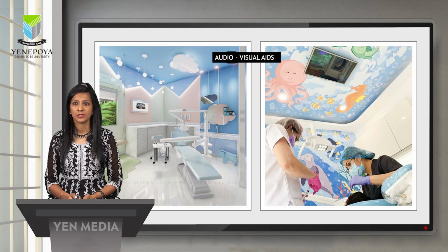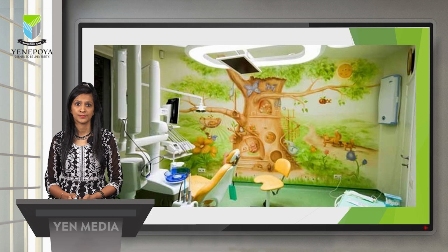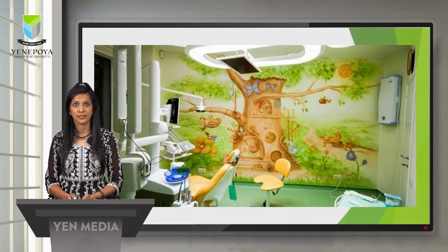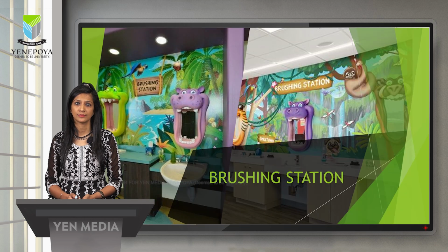This is a picture where the child is lying down on the chair and is facing upwards. The treatment is being carried out, and we have the audiovisual aids which are affixed onto the ceiling. Another pediatric clinic setup where we have a brightly colored wall and there is an audiovisual aid, a screen which is affixed onto the ceiling.